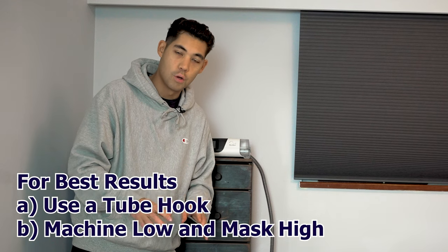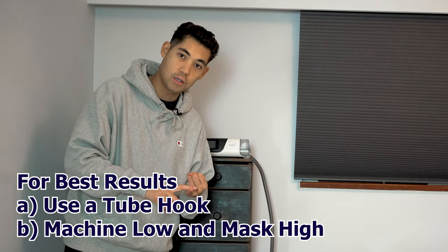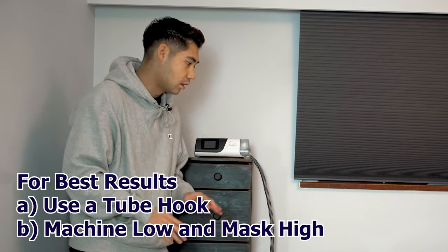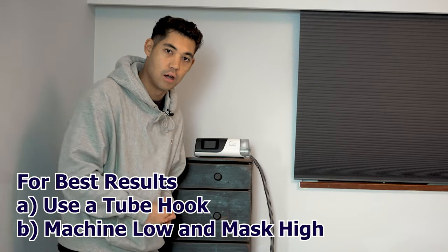In conclusion for this tip, when dealing with rainout, you either want to use a tube hook or have the machine at the lowest point and the mask at the highest point — not the machine elevated, because that's the complete opposite.